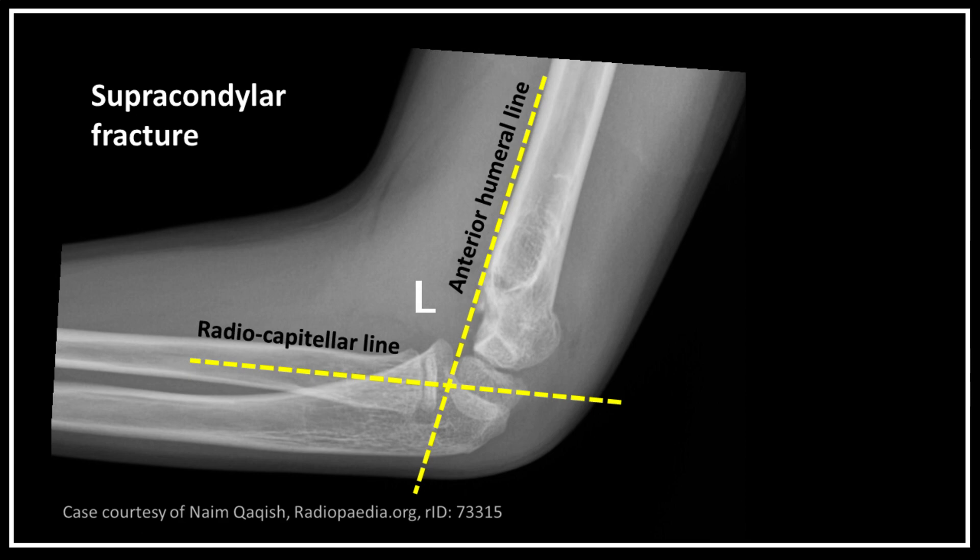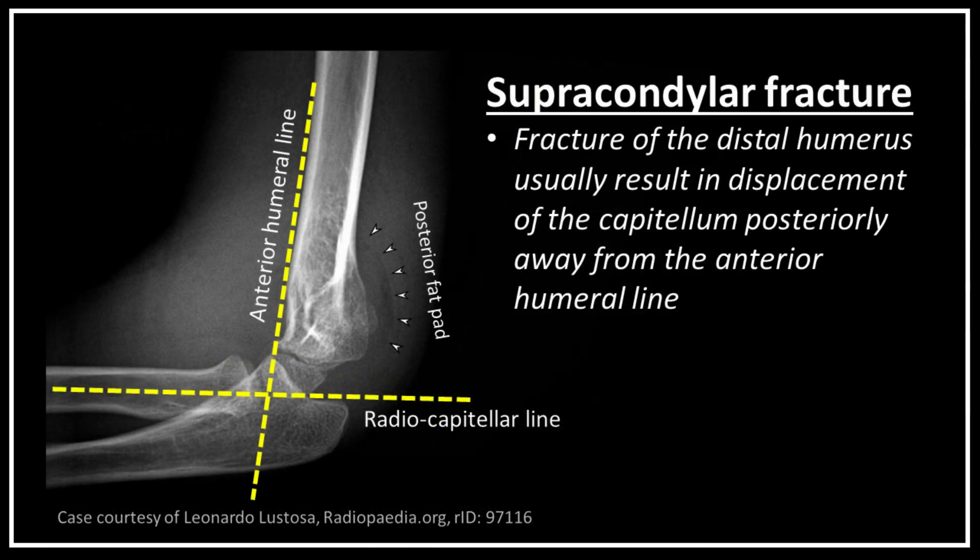In patients with supracondylar fracture, the capitellum is usually displaced posteriorly away from the anterior humeral line, and the radiocapitellar line may not bisect the capitellum as shown in the radiographs.